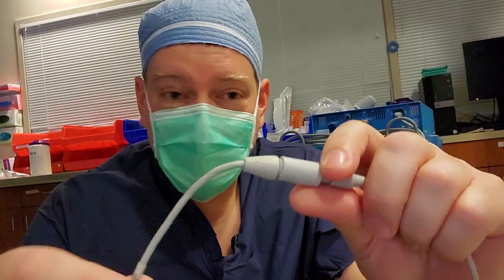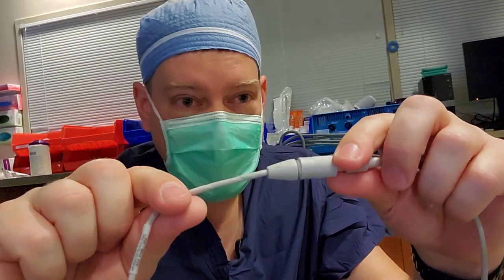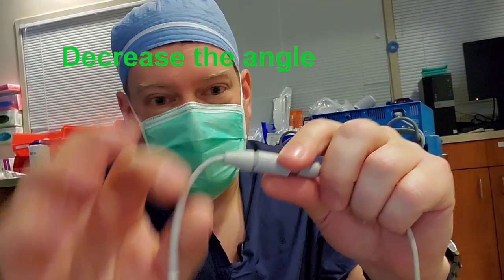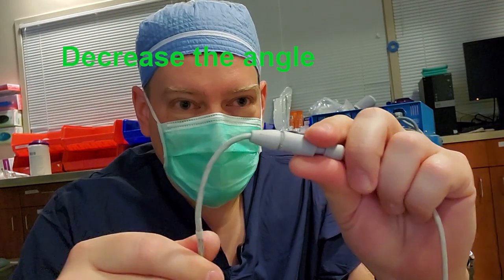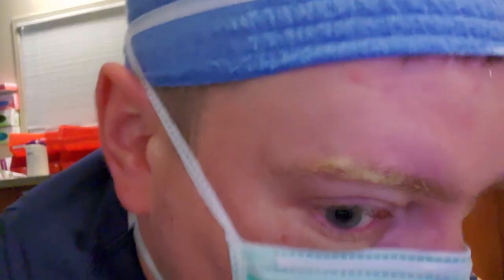So the way that we reduce that is, like I said, you put a shrink tube over the cable, shrink it down, and that gives you a more rigid angle of approach from the cable to the connector. And that is something that I'm gonna have to do throughout my cath labs here, because there's a lot of cables that are getting damaged.